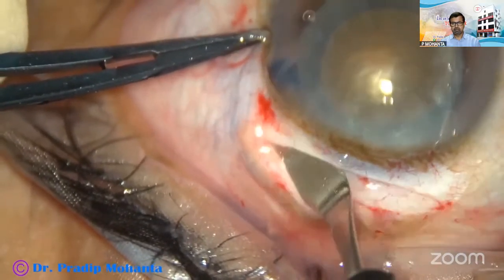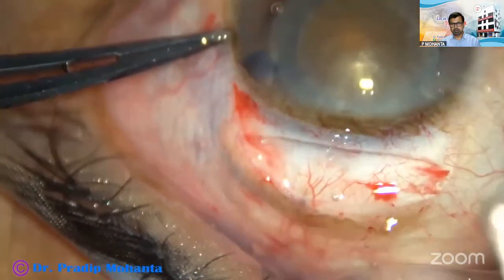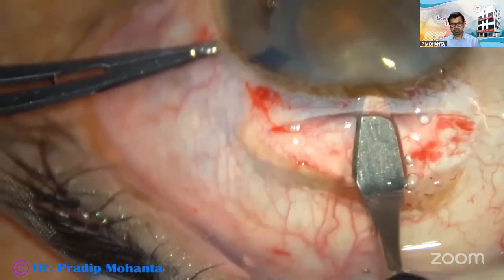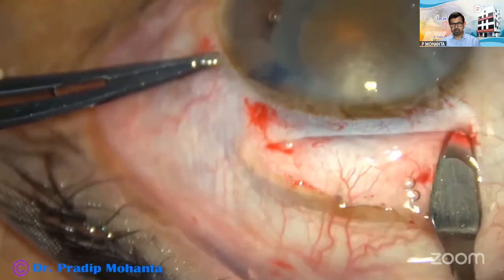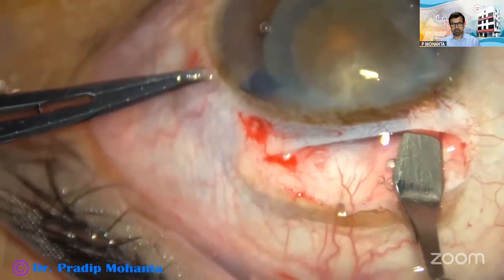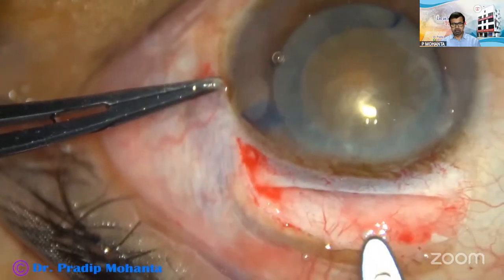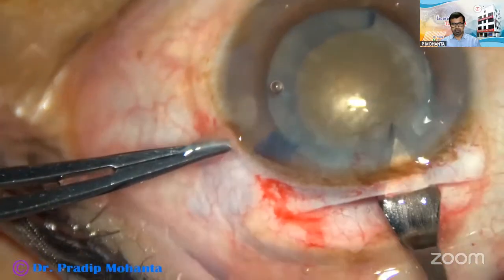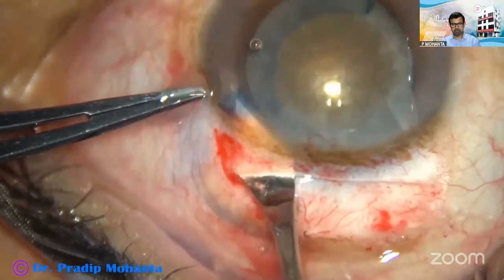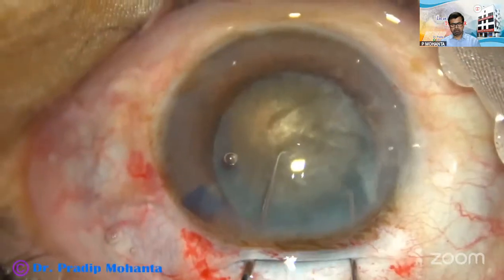Making the right tunnel is one of the most important steps of SICS. If we hurry up, we may cause lot of problems like premature entry, very thin anterior wall of the tunnel. So to make the right tunnel with good corneal valve, we have to dedicate some quality time. So the tunnel is made. This is the incision size, about 7 millimeter.